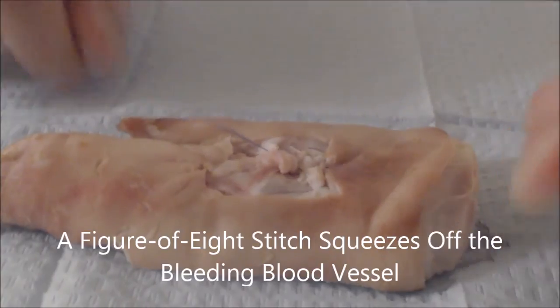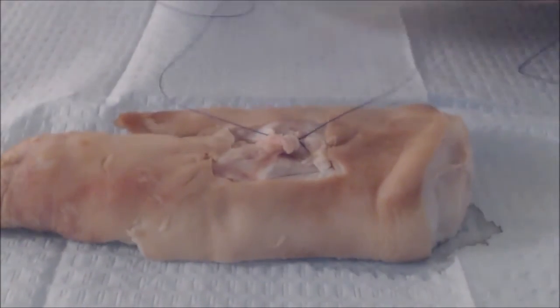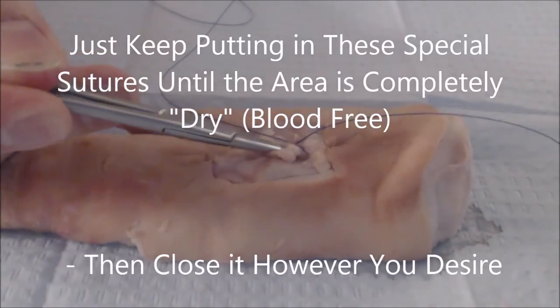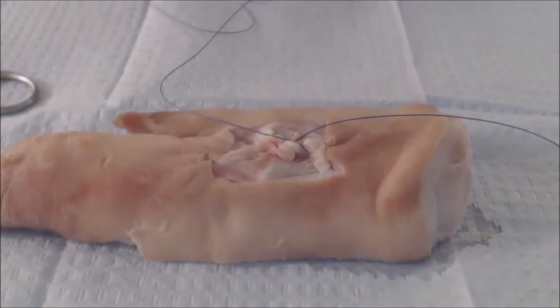If your bleeding stops at this point, you're good — simply tie the suture as one normally would, cut it, and you're fine. If there's still some oozing going on, you simply repeat. This time, perhaps, put your first suture here, your second suture here, and tie it down. Eventually, the bleeding will stop.